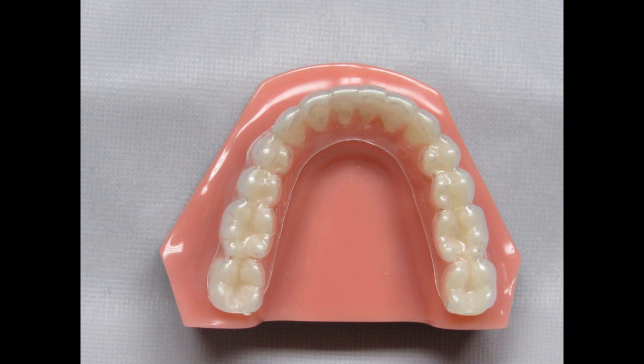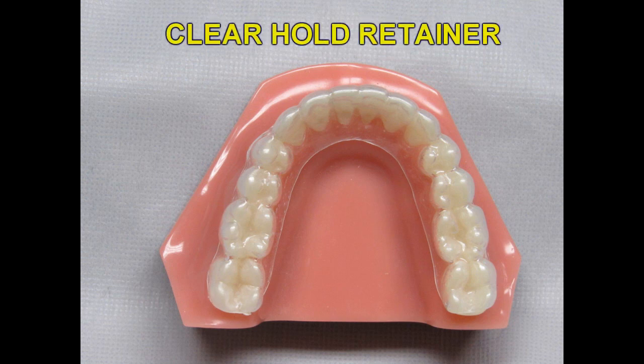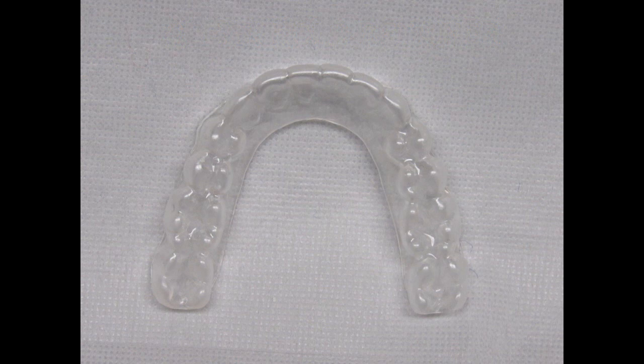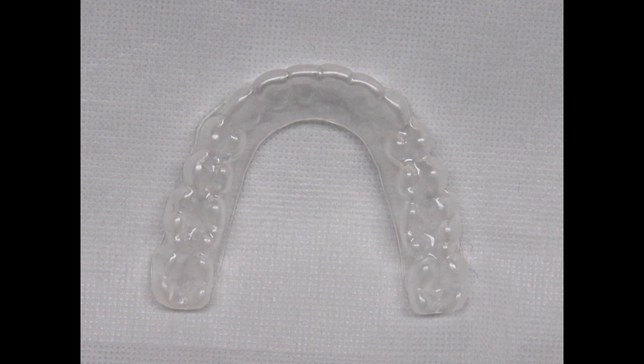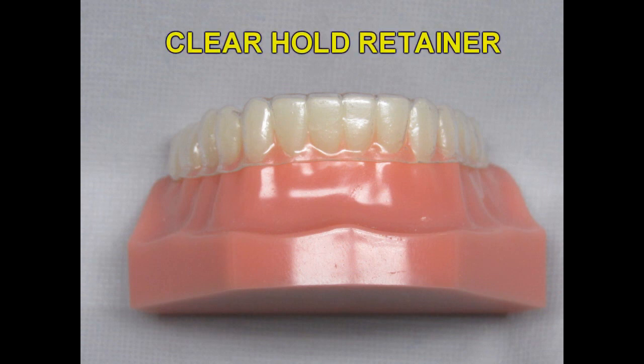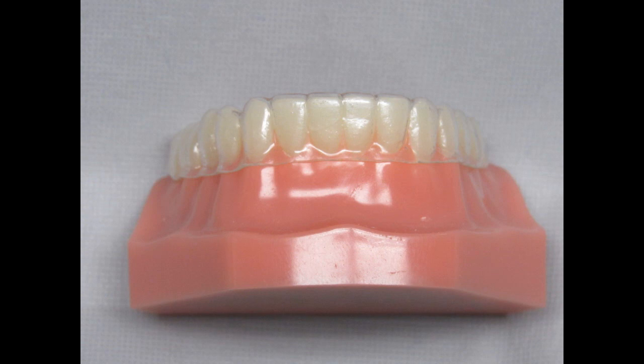For patients that want an invisible retainer or a retainer that does not have any effect on their speech, we offer a clear hold retainer. The clear hold retainers can be made on the upper or the lower arch, and we can make multiple ones for your patients to have on hand and change out as needed. Not all invisible retainers are the same — our clear hold retainers are made with a special positive pressure molding machine to ensure a better and tighter fit. These retainers will be much better than ones made in offices with vacuum machines. We have done a tremendous amount of research to find the best material available. The material we use is of superior quality, lasts longer, and is more resilient to staining over time. You and your patients will be very impressed with our clear hold retainers.